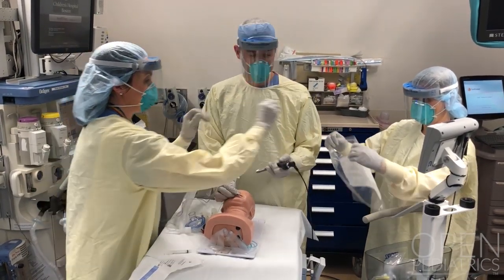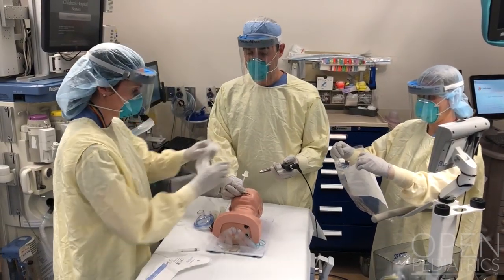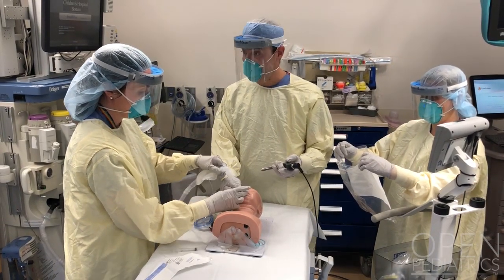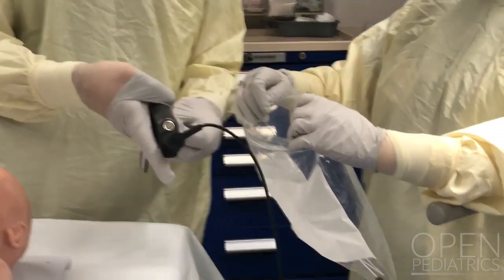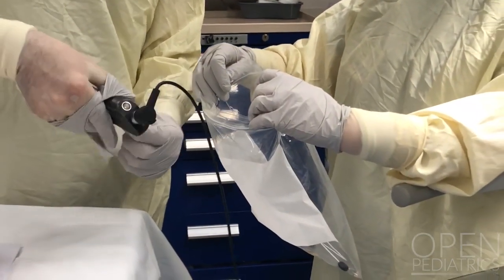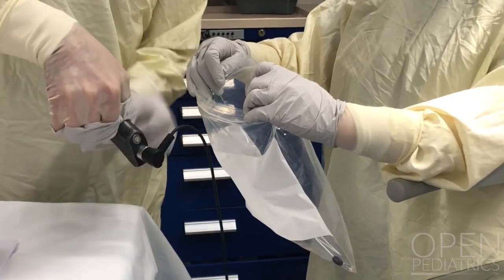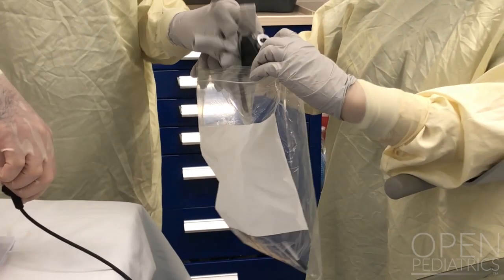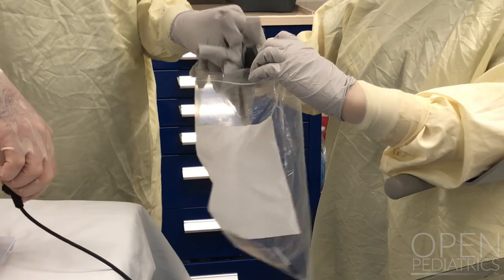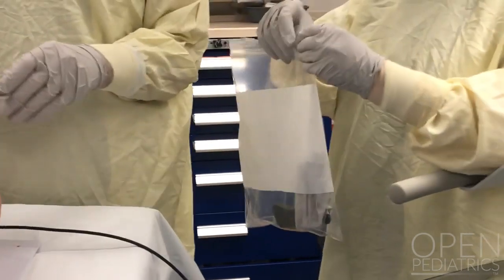The airway and the circuit can then be handed over to the second airway provider so that the intubator can remove the glove and resheath the laryngoscope blade. The blade and the glove can then be dropped into the sealable plastic bag held by the anesthesia tech, who will then follow their policies and procedures for resterilization of this equipment.